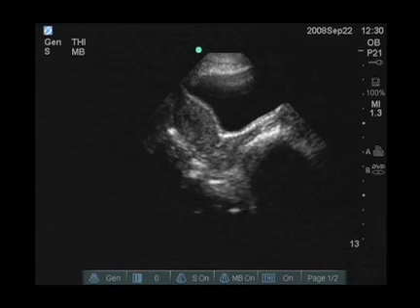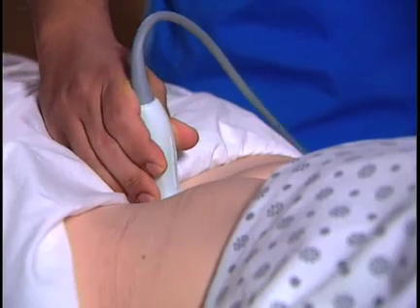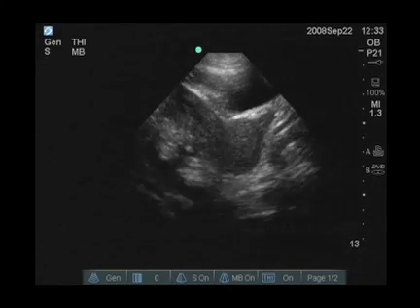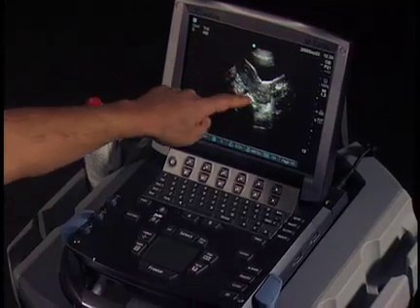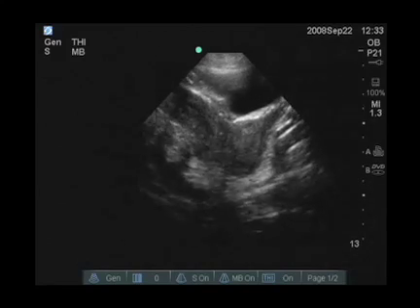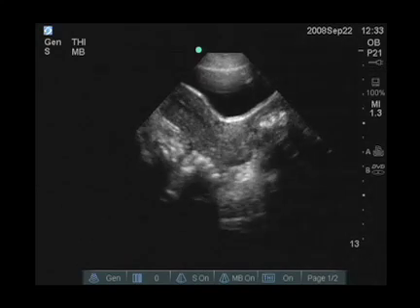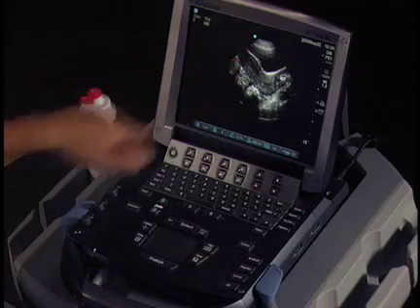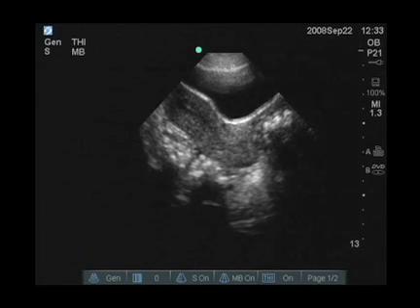Once we're in the sagittal view, we're going to scan from the patient's left to right. When scanning in the sagittal plane, you identify the bladder at the top. Below that, we see the pear-shaped uterus, and within the uterus we see a very thin line which is hyperechoic, or white. This is the endometrial stripe. If the patient was pregnant, we would be looking for signs of pregnancy within this area, within the mid-uterus.